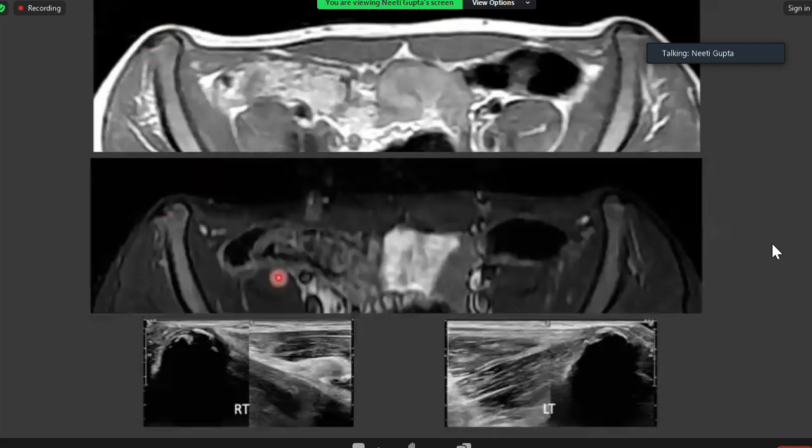A big added advantage of ultrasound, as we all know, is that it can be guided by the patient's symptoms. So, where she said, I have pain, you keep the probe, and many times you will see the abnormality there. And so, ultrasound can help to detect even minimal cartilage and bone abnormalities. So, in the absence of marrow edema and a chronic epiphyseal injury, findings can be really subtle, and you can always use ultrasound for correlation.